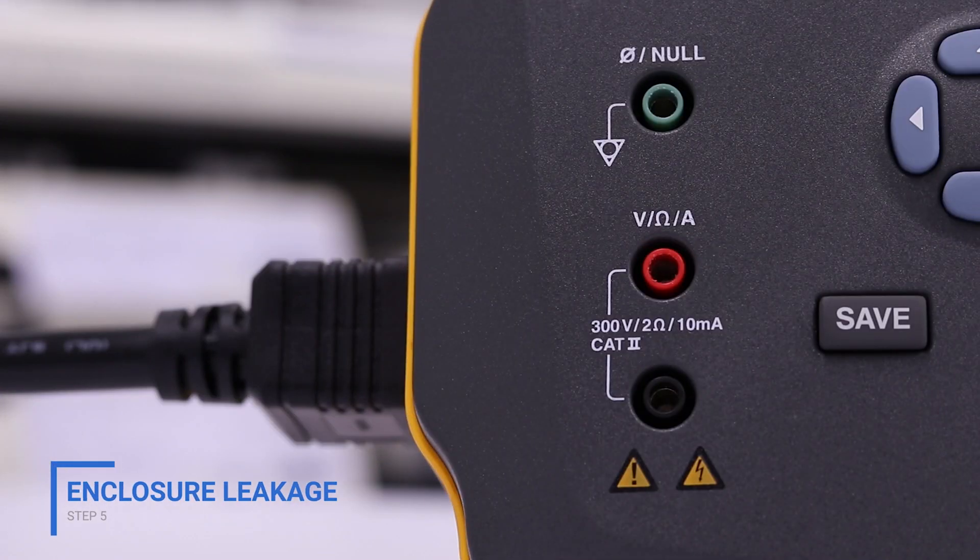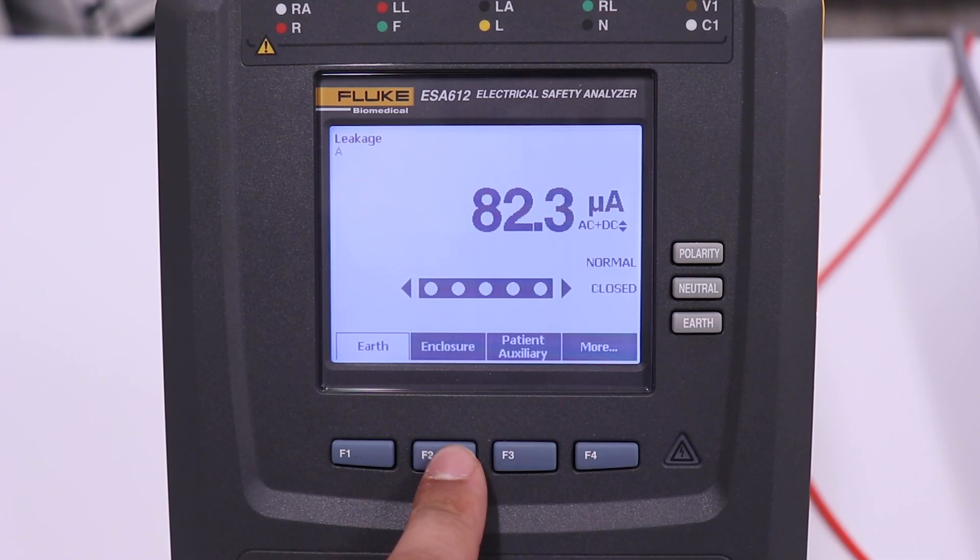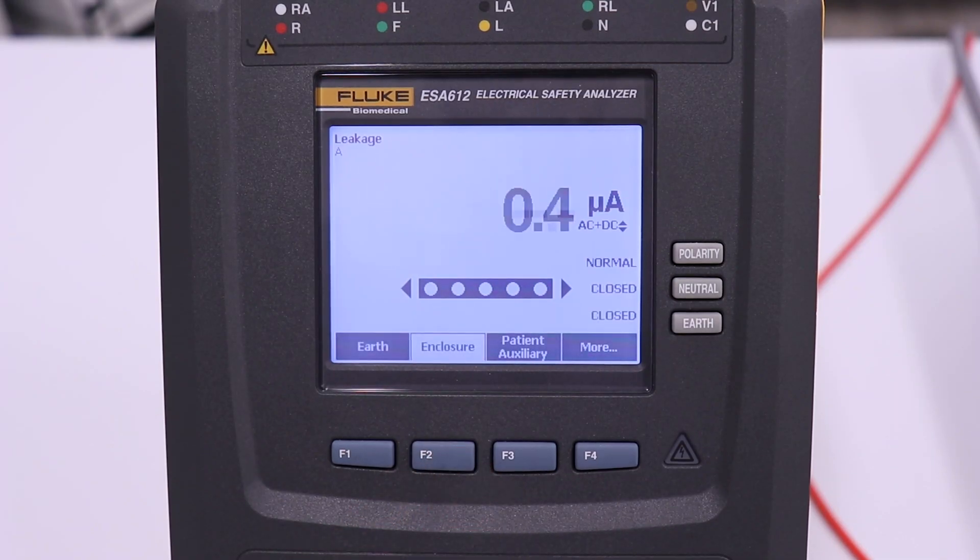Enclosure leakage displays the current that would flow if a person came in contact with the housing of the device. Place the alligator clip on the upper panel. Press the F2 button on the ESA to select enclosure. Test for normal polarity, closed condition, and single fault, open neutral condition.